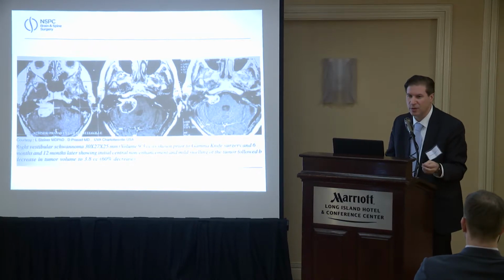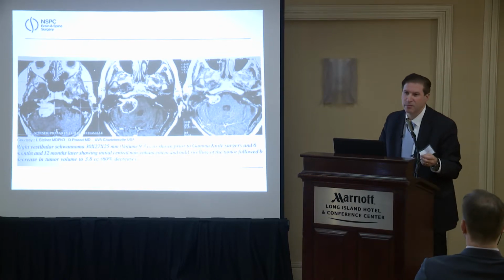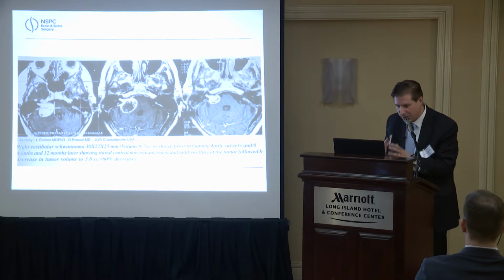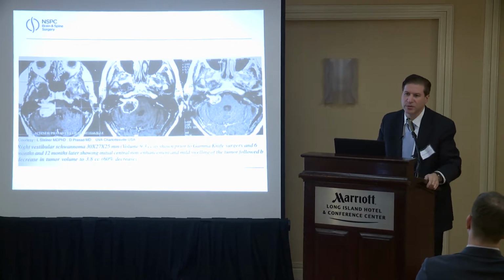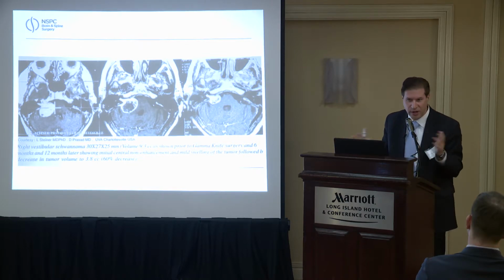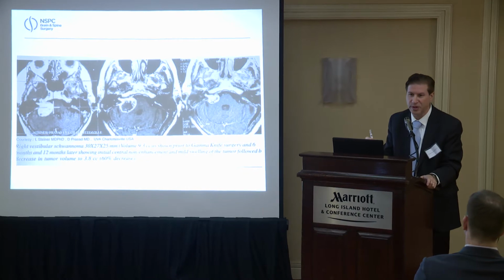And again, almost all of them I'm doing Gamma Knife on. If the tumor's enormous, I believe, and I think a lot of people are now saying, just debulk it. Don't scrape it off the nerves. That's where all the complications arise from, and do Gamma Knife on the residual. Also, I would say we're quoting for results with the new, lower dosing for Gamma Knife. The facial weakness almost never happens. I've done over 100 Gamma Knife just for acoustic. I've never had anyone with any facial weakness. I had one person who had the most minimal amount for like 3 weeks and it went away.